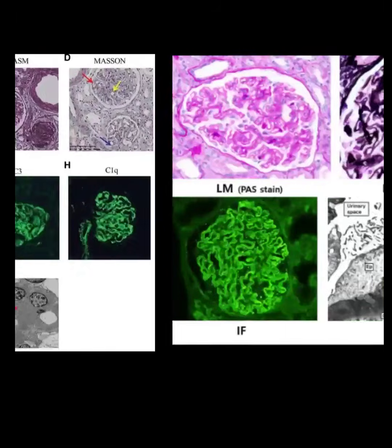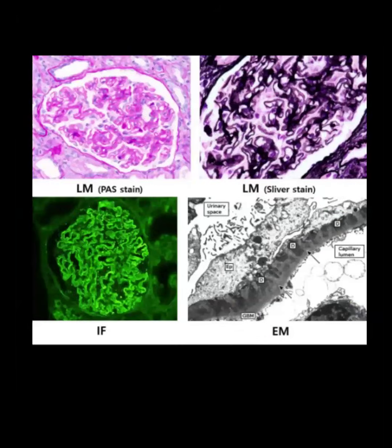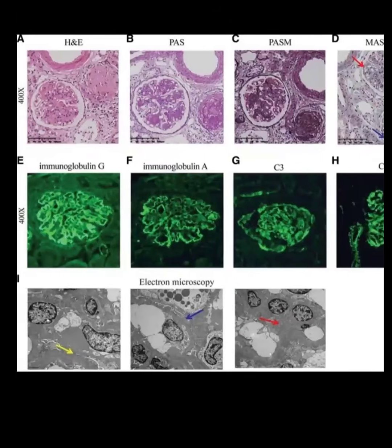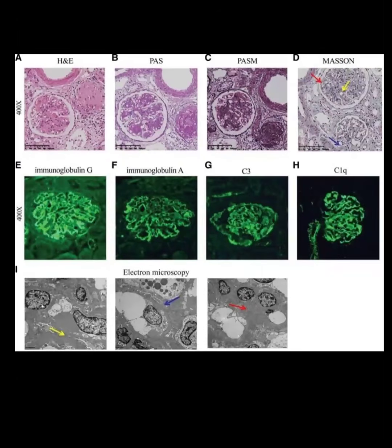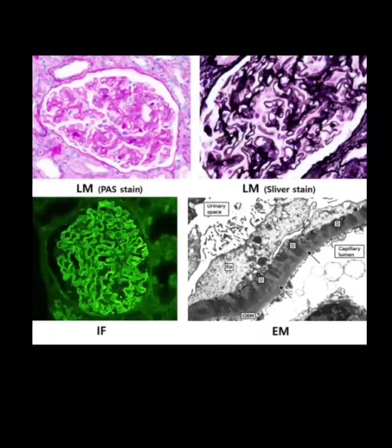You can see there are different types of stain. On the leftmost corner, it is an H and E stain, and nuclei are appearing purple, and eosin is for the red cytoplasm. Here it is the magenta color on the topmost. This stain is periodic acid Schiff stain, and on the right top, that is the silver stain that usually looks a little bit blackish.